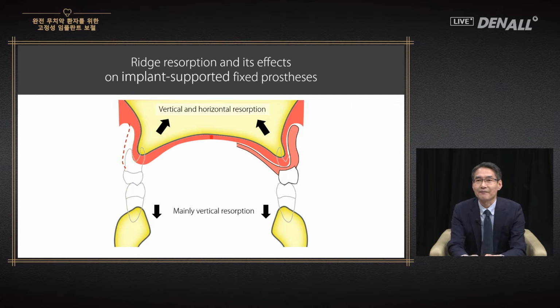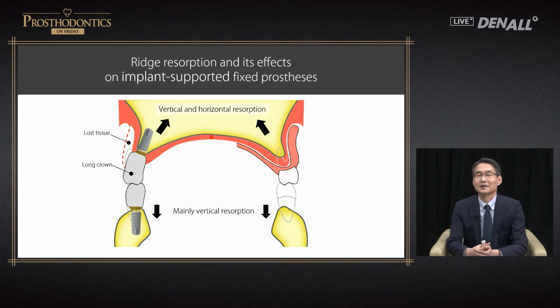I've come up with the frontal image. On the image on the right, the patient was fully edentulous and full denture was used. The denture base compensated for the lost volume of alveolar bone. It did not affect the patient profile significantly. However, when I tried to place the implant, because there was vertical and horizontal bone loss at the same time, it was difficult, close to impossible to perfectly repair the loss that has occurred buccally. The crown was too long and aesthetically unfavorable.